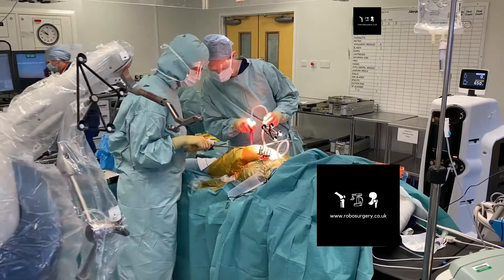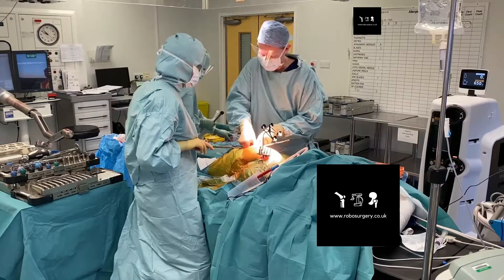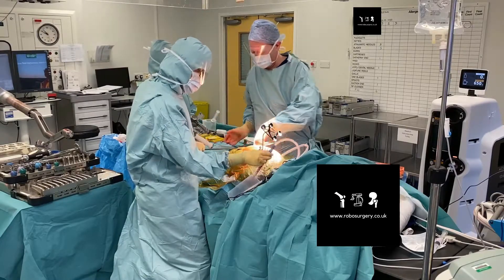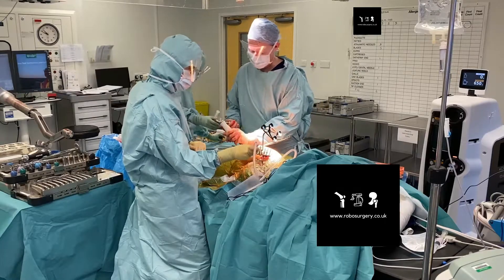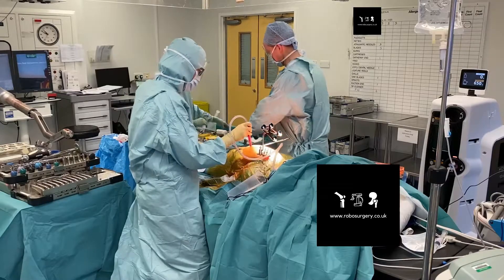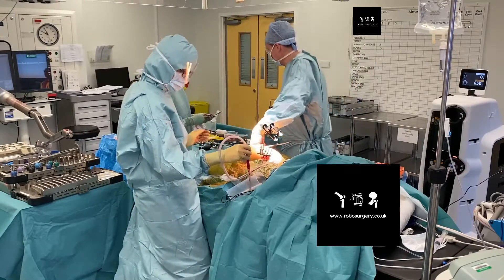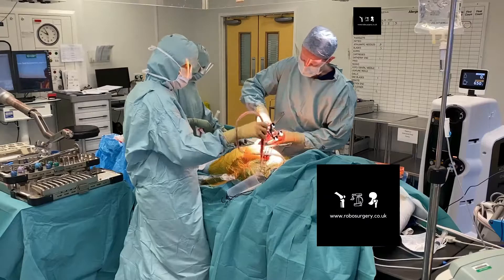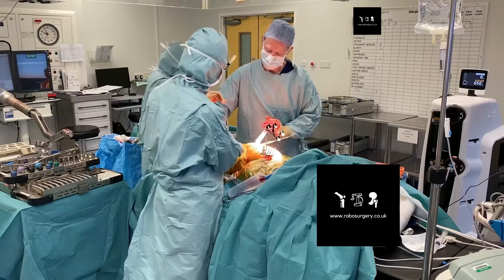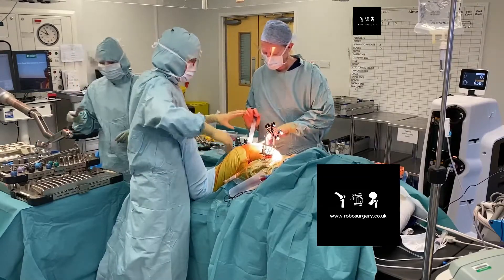As we impact the component, it tells us how far we've impacted the implant, so we don't really have to look at how well it's seated — the robotic system tells us whether it's down to the floor by the millimetre. It goes from one centimetre as you impact it down to eight millimetres, five millimetres, down to zero millimetres once it's flat on the floor. Here I've impacted the acetabular liner and we're now ready to progress on to the femoral preparation.